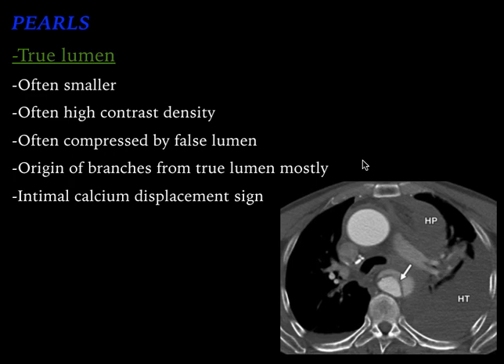The most important feature of the true lumen is that it is usually smaller in size. You can see here this is the true lumen, which is slightly smaller in size. It often has high contrast density — you can appreciate the contrast density here. The false lumen has less contrast density, and the true lumen is compressed by the false lumen. Also, when the dissection flap extends to the branches of the aorta, the origin of the branches — such as the celiac trunk or SMA — usually arises from the true lumen. Wherever they are communicating, that should be the true lumen in most cases.